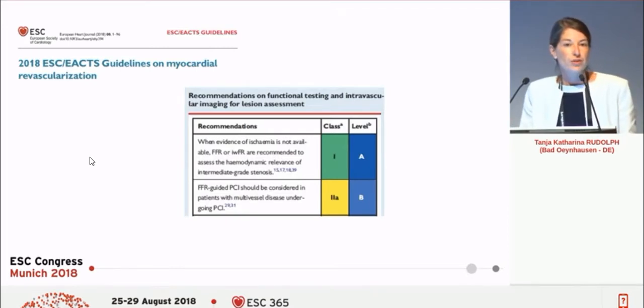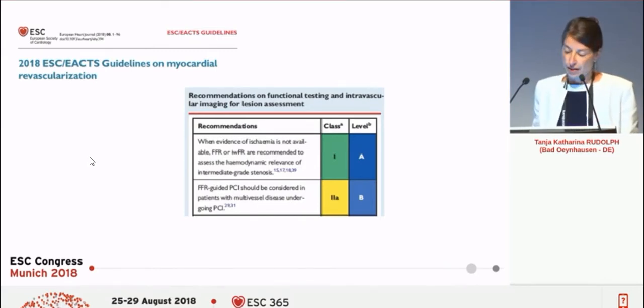And now I would like to use the next minutes to share with you two cases, a little bit more complex cases, where we have an additional benefit when we are using FFR and iFR.